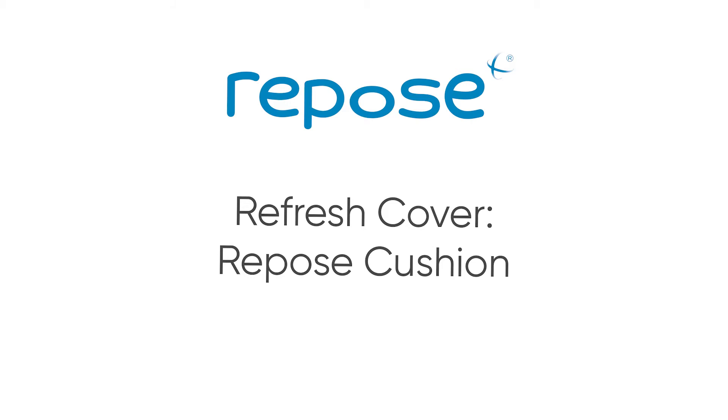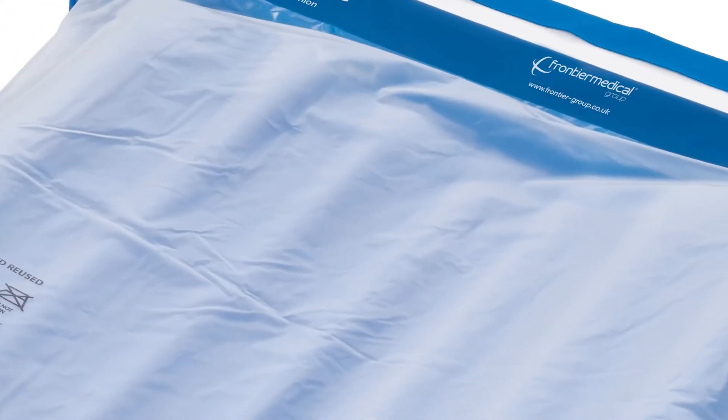The Repose Refresh Cover is a replacement outer cover for the Repose Cushion.